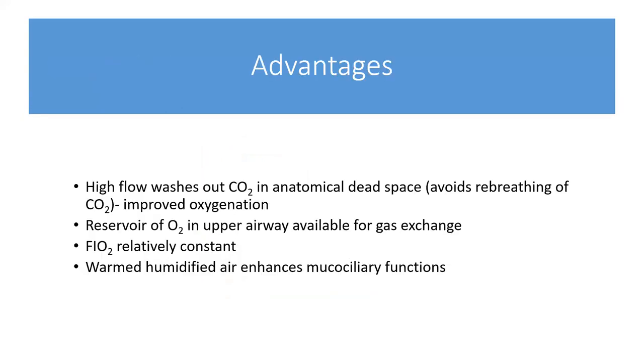And the advantages of the high flow nasal cannula is that it could wash out carbon dioxide from the anatomical dead space. It creates a positive pressure, which actually maintains a relatively constant FiO2. And because the gas is generally warmed and completely humidified, there is going to be an improvement of mucociliary functions. The cilia can remain good and can function well to remove anything that is obstructing the respiratory system.